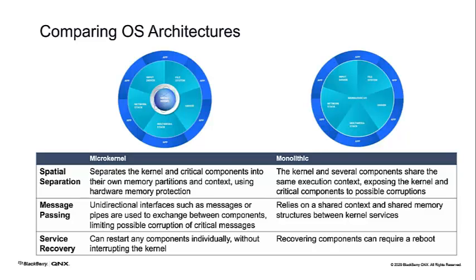The safest method is to just do a message pass where you'll pass a message and there's a copy into the new data space. But that's not necessarily the most efficient. And certainly if you have a high bandwidth sensor, maybe you need to establish a shared memory region between two applications. You can do that, but make sure it's bounded and it's built into your safety case so that that buffer can be shared between them in a safe manner, and only those two applications. So it really matters in terms of how you want to put those together.